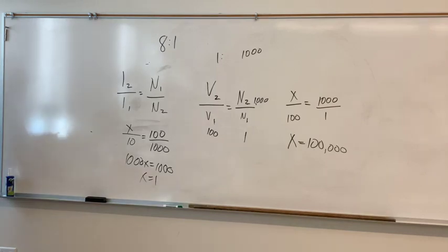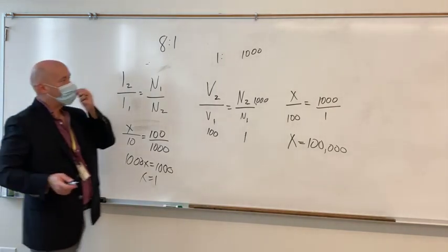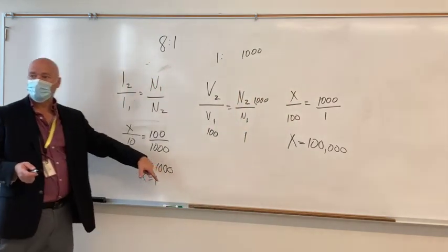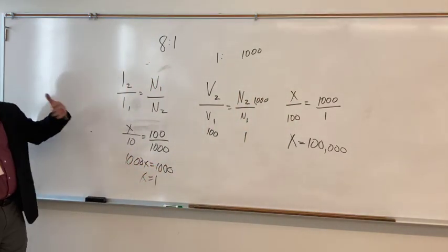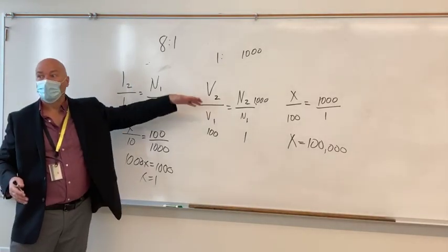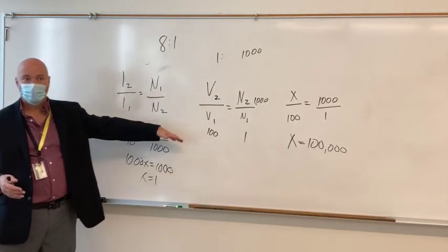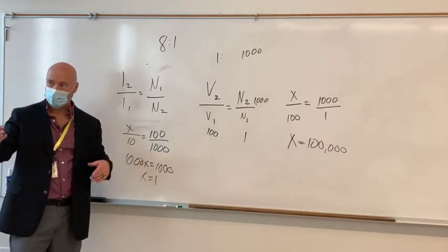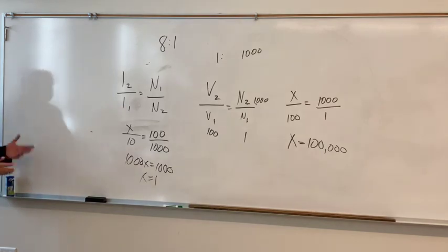So in a step-up transformer, what we're going to have is an increase in voltage and a decrease in amperage, okay? So what I was doing there was, I went from a step-up transformer, which should have a step-down in amperage, to a step-down transformer, which is going to increase amperage. So I changed my perspective.